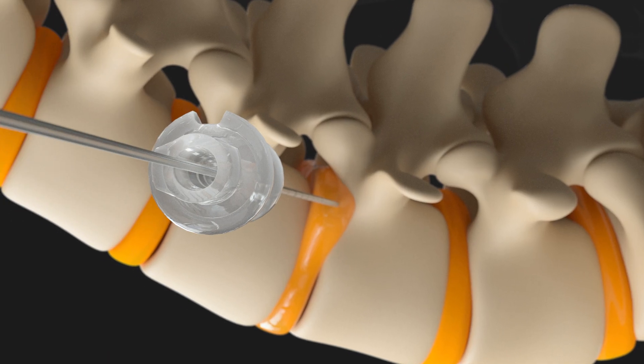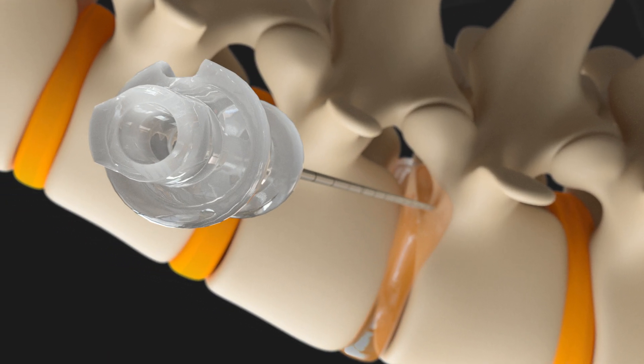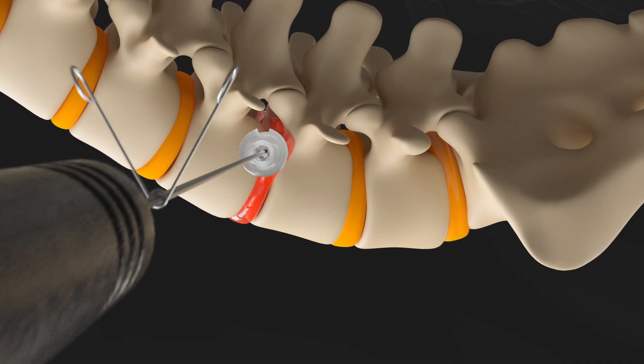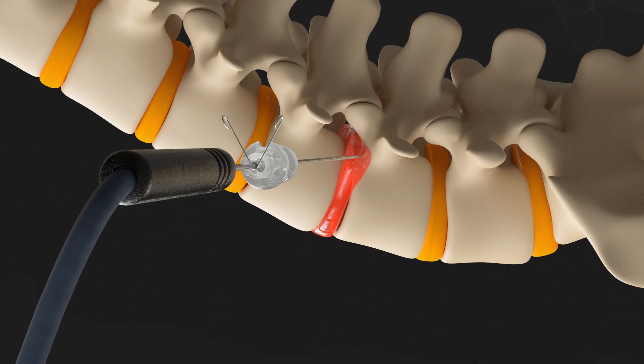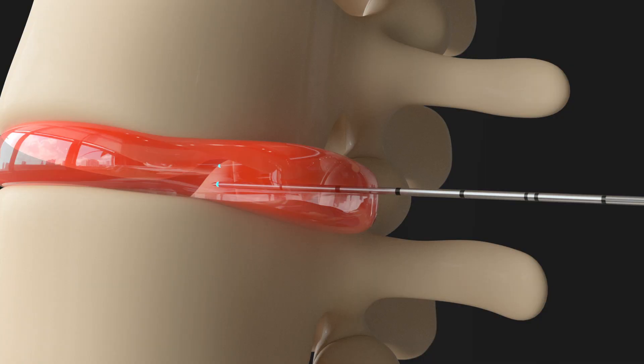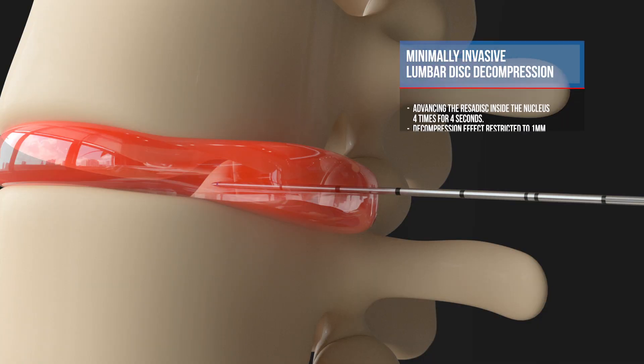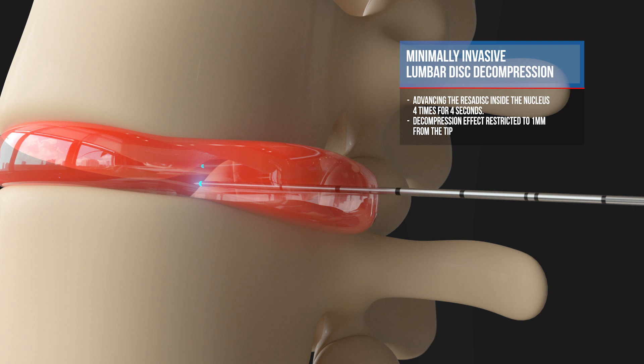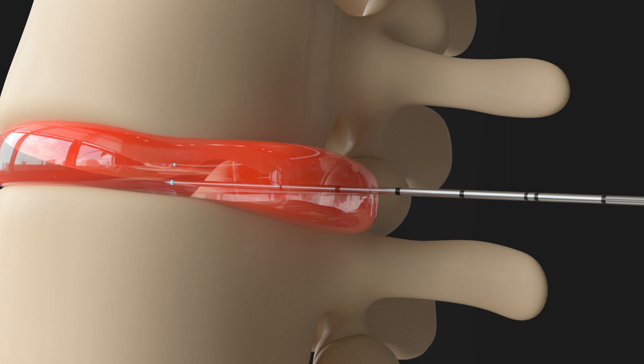Pull out the stylet, insert Resadisc and connect it with the Resoblator Smart. Perform disc decompression by advancing the Resadisc inside the nucleus four times for four seconds. The resulting effect is focused one millimeter from the electrode tip.